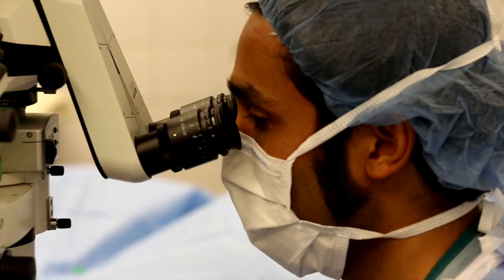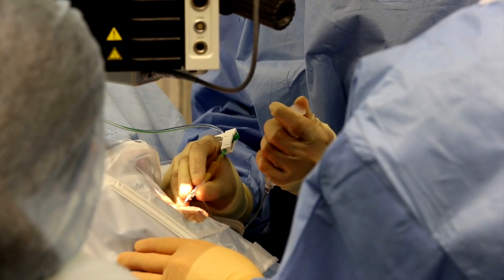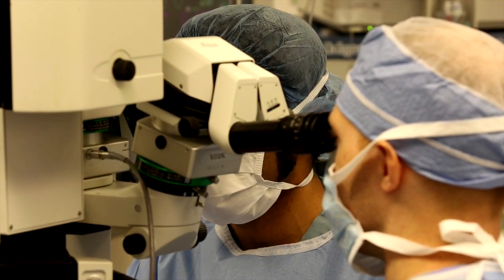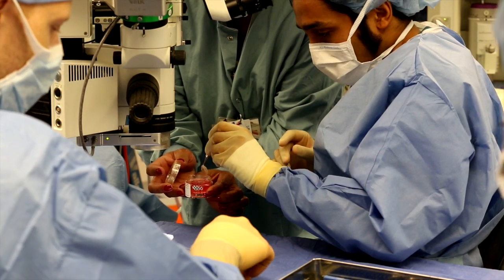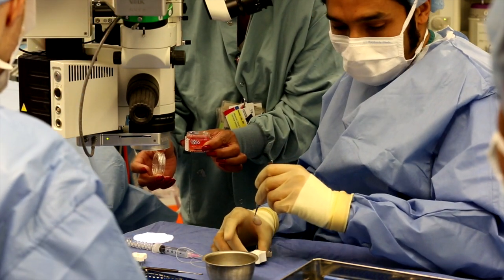This DMEK, or Descemet membrane endothelial keratoplasty, is a new procedure that was developed. And in doing that, they're basically doing a very delicate process of stripping the back layer cells, those endothelial cells that are responsible for keeping the cornea clear. They have a membrane underneath those cells. It's called Descemet membrane. So the technician has to very carefully strip that membrane with those cells gently across the entire surface of the cornea, and then put it back into the preservation solution. So that's a very delicate stripping.